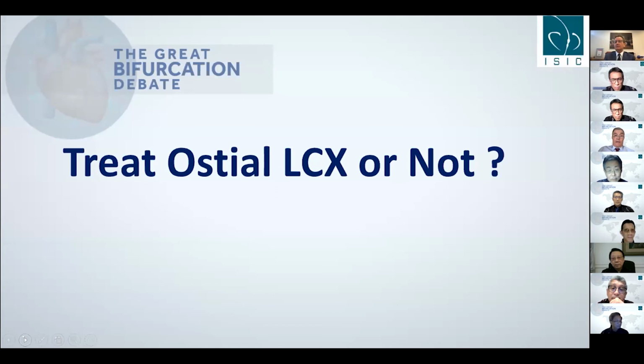One was about trifurcation, and I said that in view of EBC, for us, trifurcation has the same rules of the fractal geometry, just modified for trifurcation, but the stenting strategy is very similar. We just have one more additional wire in the third branch. Someone also suggested DK crush, as Professor Santoso did, crushing the LAD stents and converting to DK crush. So these are the two questions. If there are other questions, please go on.